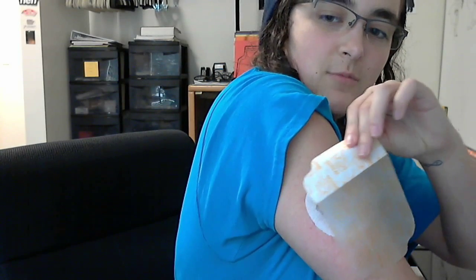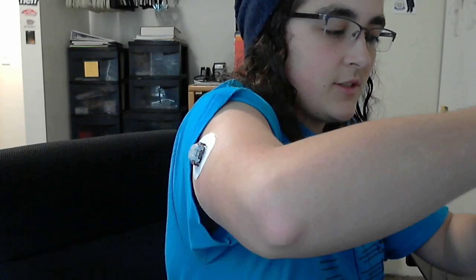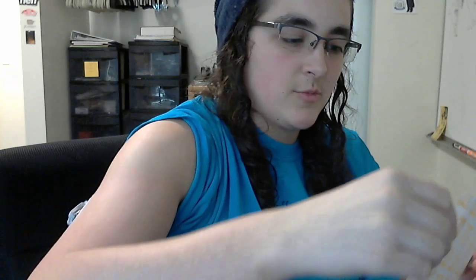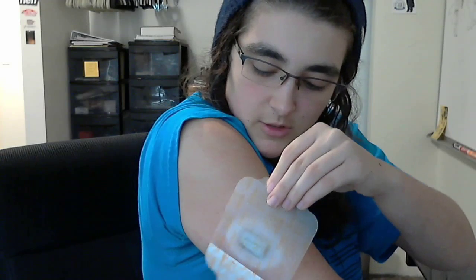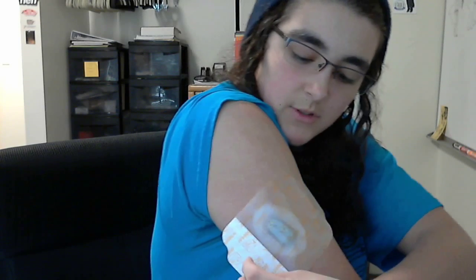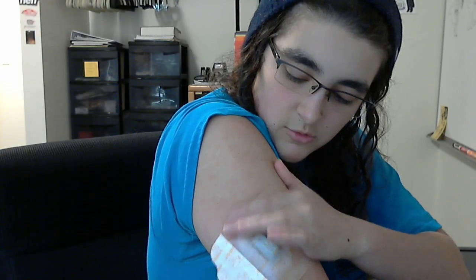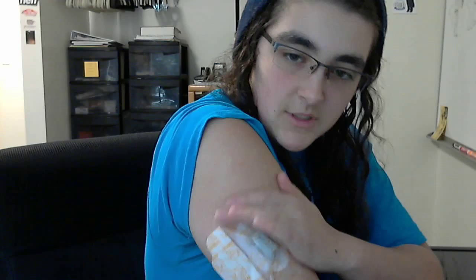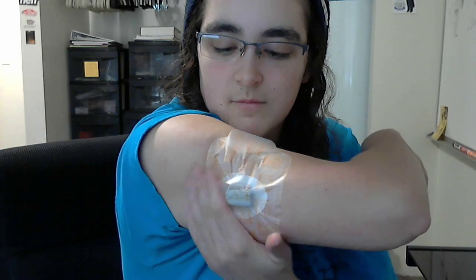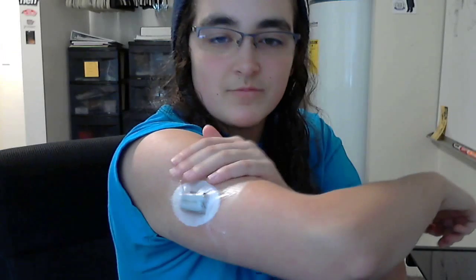Now I'm going to take one side off. And you'd think it'd be better if I did it this way, with the way that the sensor is, the dimensions of it. But I found that with that way, this wrinkles a lot, which really bothers me, so I normally actually stick it this way. So I'm just going to get one side down. I do a pretty bad job of this when I'm on video, but probably gonna make it wrinkly anyways. Once I get that down, move the other side, and then you can just peel off, and boom. So that is how I put in a sensor.